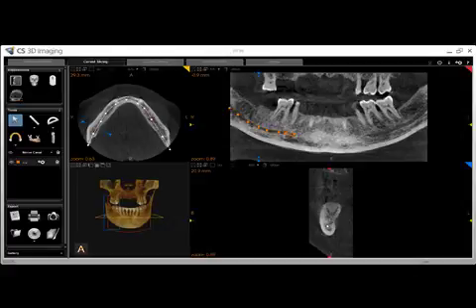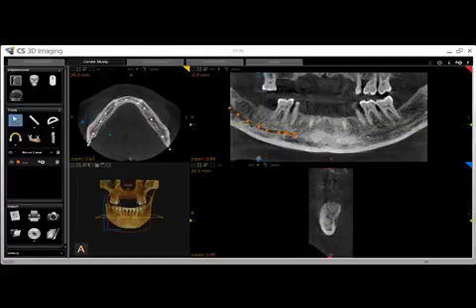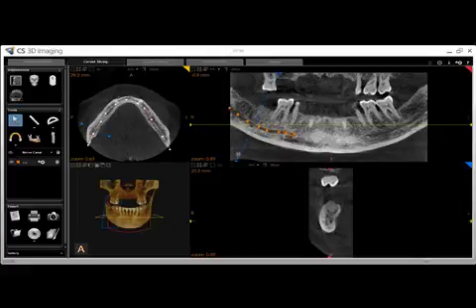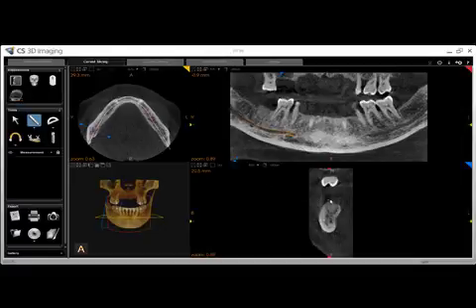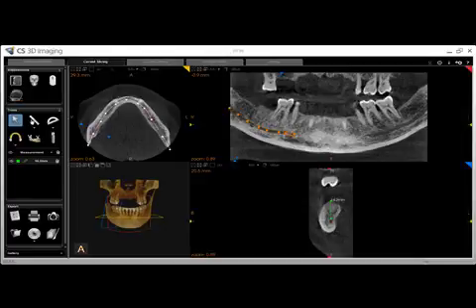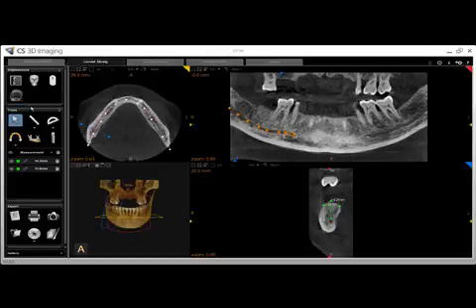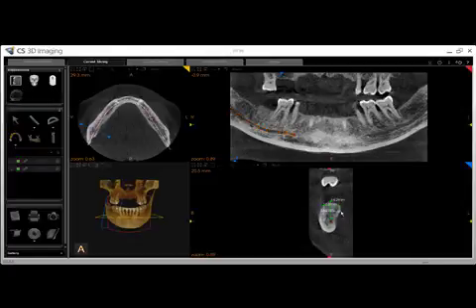To evaluate a site for a potential osteotomy, use the large blue ball to move to your region of interest, then use the smaller blue ball to angle the transaxial view from a vertical orientation to one that will more closely match your implant placement. You can then perform measurements using the ruler tool — click the ruler tool, then a single left click to start the measurement and another to end. You may do as many measurements as you like, and you may also click the maximize button to go to full screen on the transaxial view for accuracy.